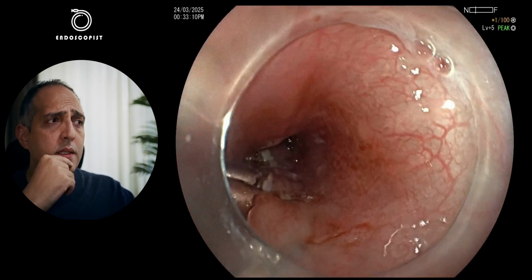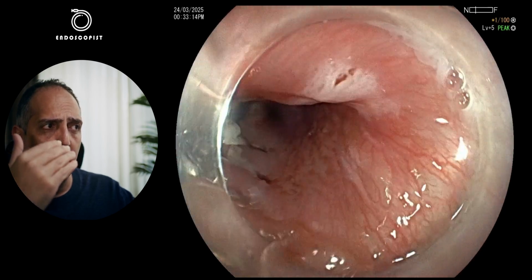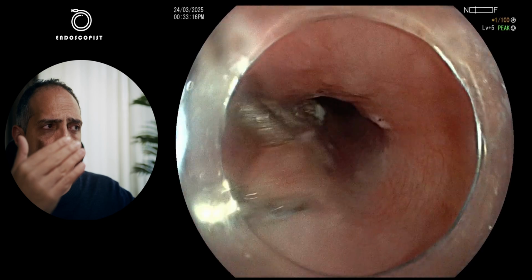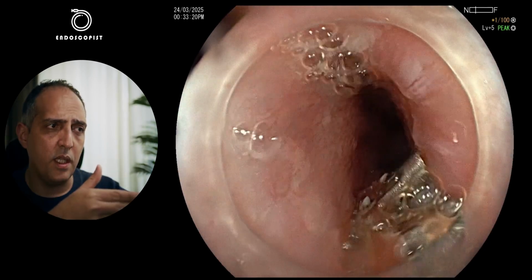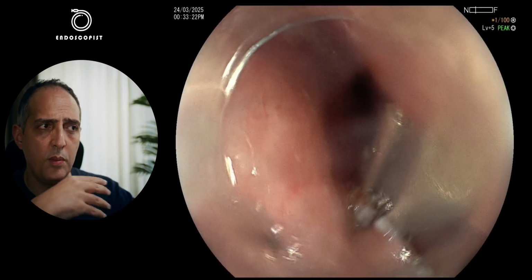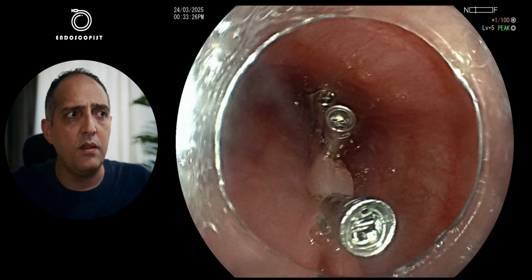And here we put our last clip. After the last clip, I go one time to the right of my clips to make sure that all the clips are grasping normal mucosa, and again to the left of these clips to make sure that they are also grasping normal mucosa, and the procedure is finished.